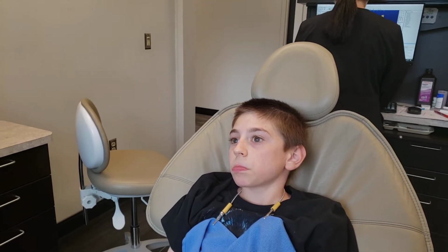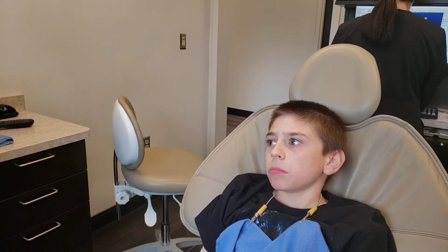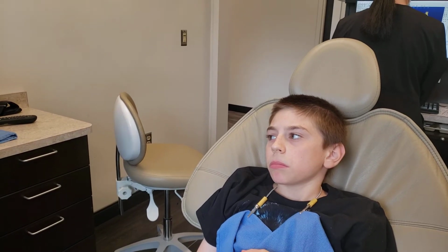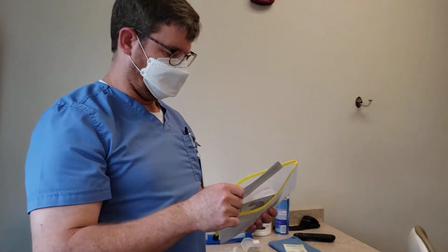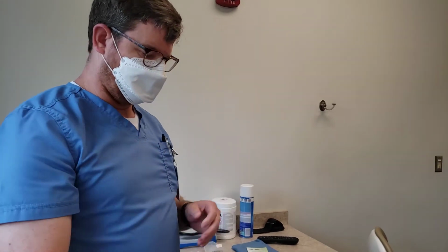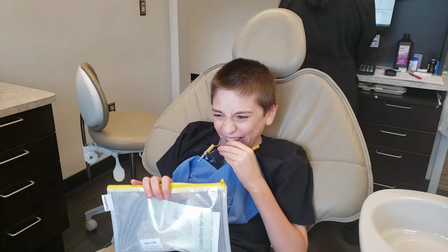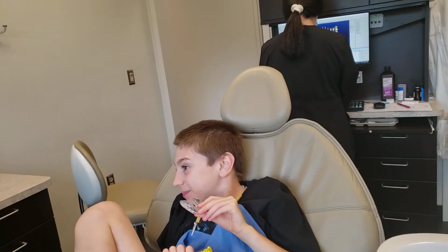All right. I'm going to put this case in here, and I put that new chart for the occlusive guide. So habit corrector at night for him, and then 2 hours a day passively, just with his teeth in the appliance and his lips together. And he'll get used to it. Okay, great. Here's your stuff, buddy. What do you say? I want you to keep that in there. He'll learn how to swallow with it. That's the trick.